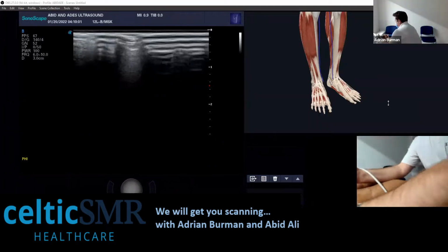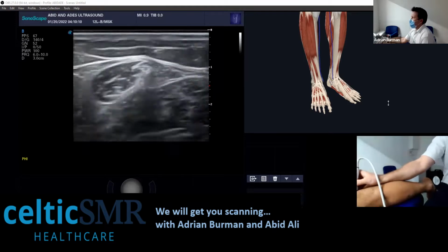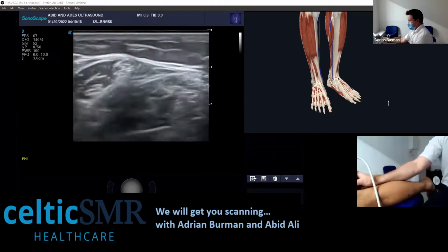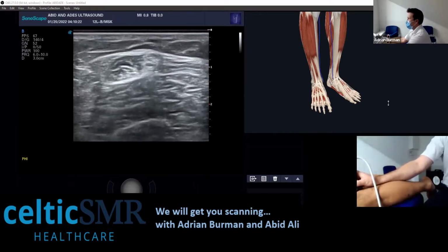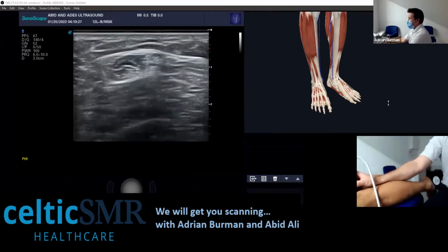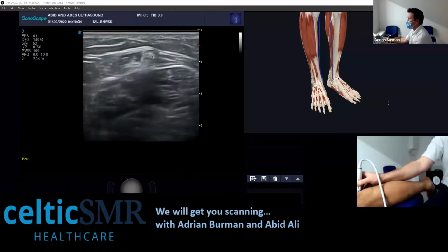When you talk about popliteal fossa, I'm thinking of your Baker's cysts and things like that. So the thing to do is I start a little bit higher up into the thigh, and I'm looking for this structure here. Okay. So move the depth up a little bit. Oops, the other way. Okay. So I'm looking for this structure here, which is your semitendinosus tendon.